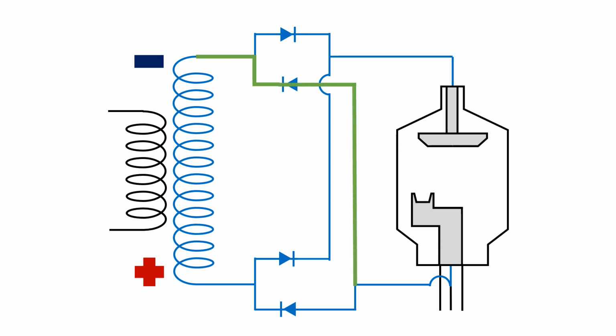The electrons then travel to the next split. Will they continue going down or veer off to the side? They'll go to the side because this diode would block them from continuing. Now the electrons can travel across the X-ray tube and onto the other side.